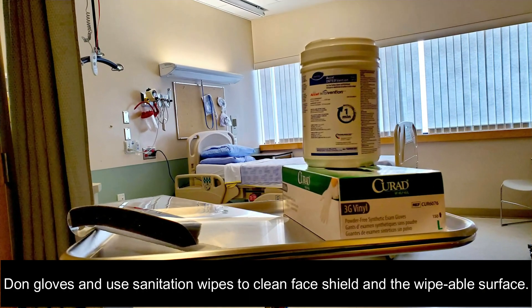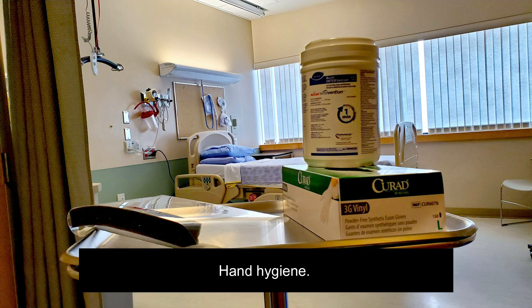Don gloves and use sanitation wipes to clean the face shield as well as the wipeable surface. Remove gloves.